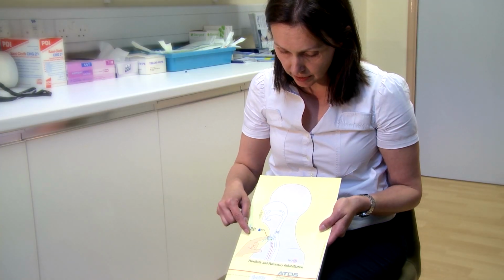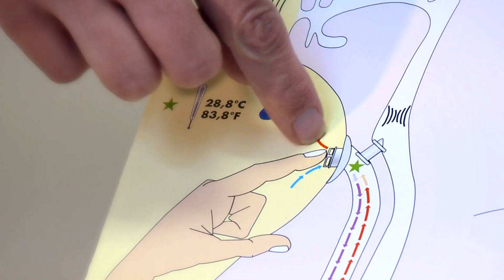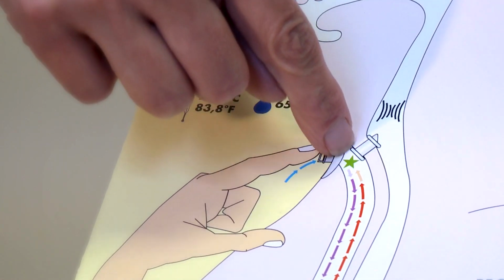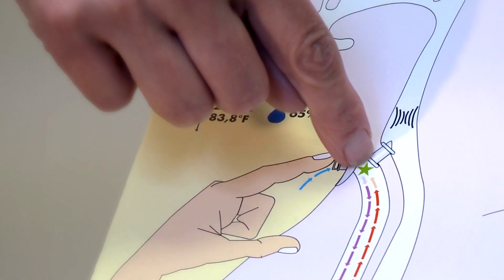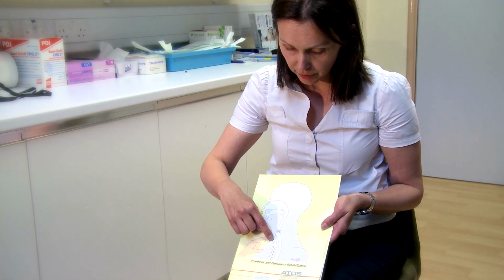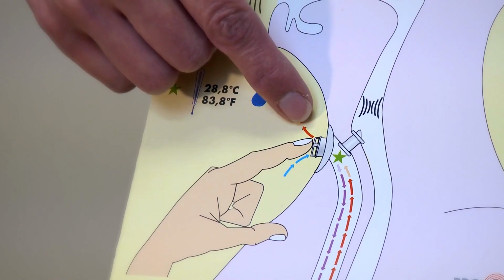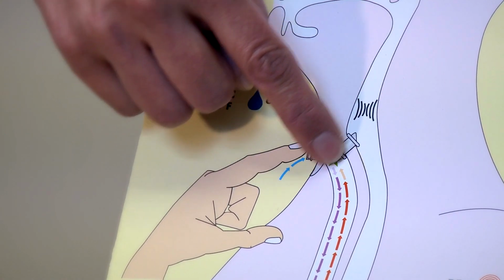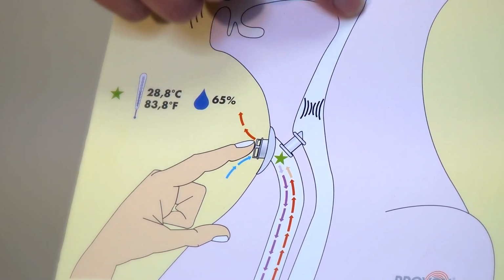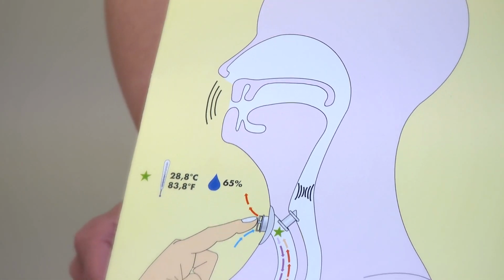The voice prosthesis is a silicone device which sits between the back of the airway and the gullet. So when the stoma is covered, the air is pushed through the valve, which is a one-way valve, up into the mouth so that voice can be produced by a segment of the pharynx being vibrated to produce voice.